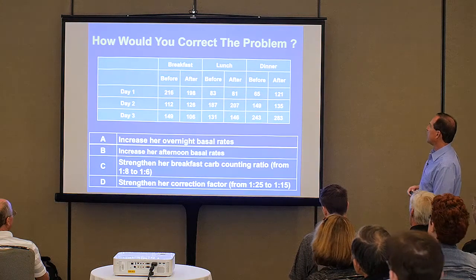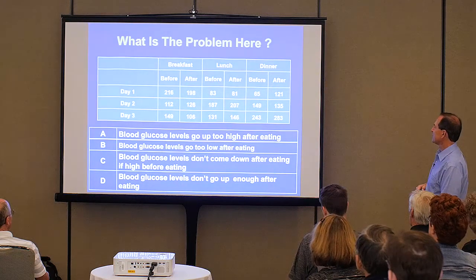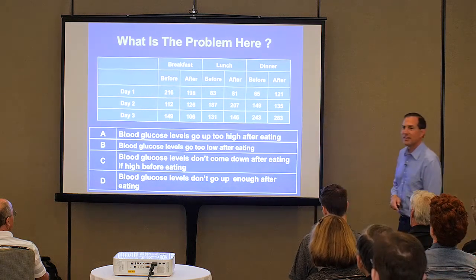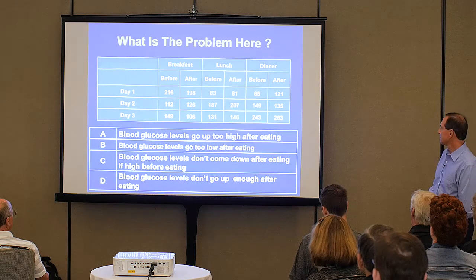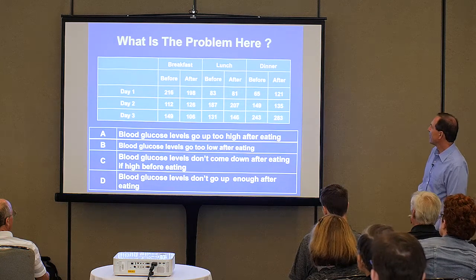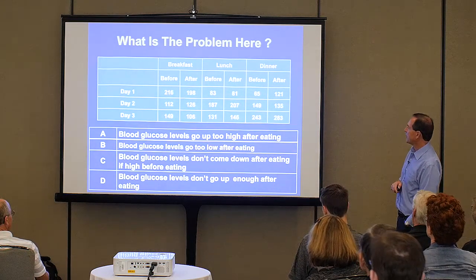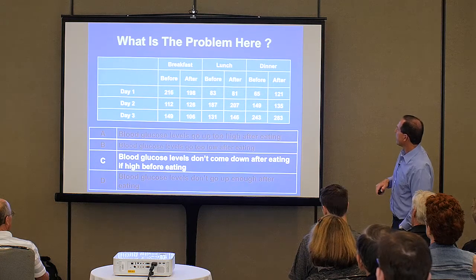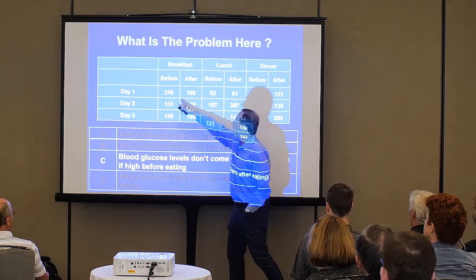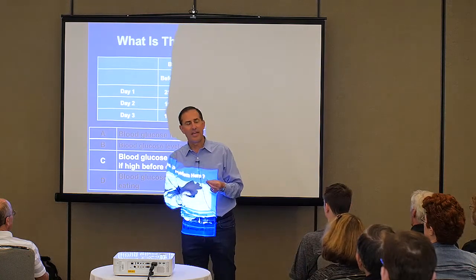All right, so I already gave the answer, but it doesn't matter. So look at those numbers. These are different options, but is there anything you notice there? They are kind of all over the place. If I was to pick out one thing that I would notice, it's that if they start off high, they end up high. If someone's pump is set optimally, that's not going to happen.